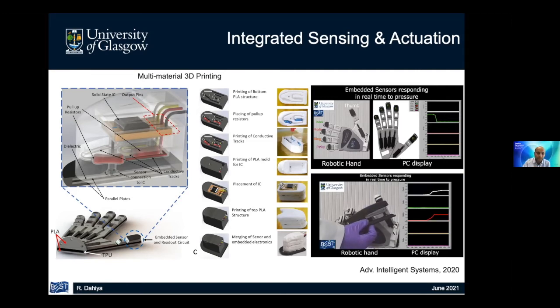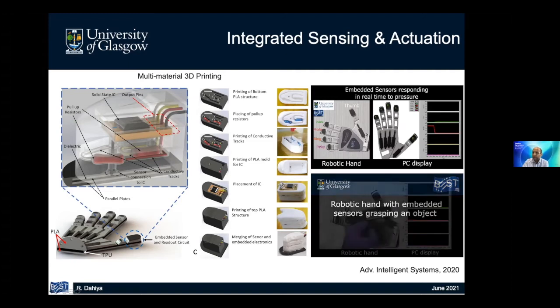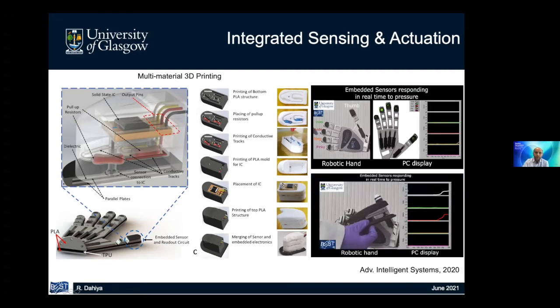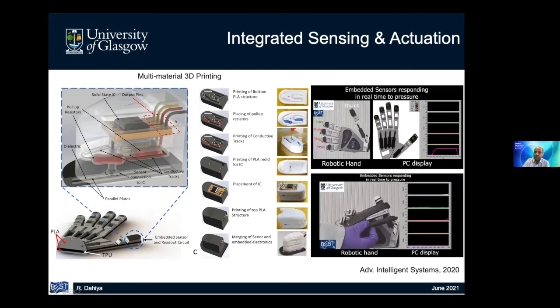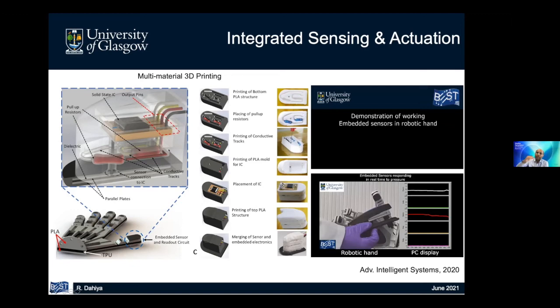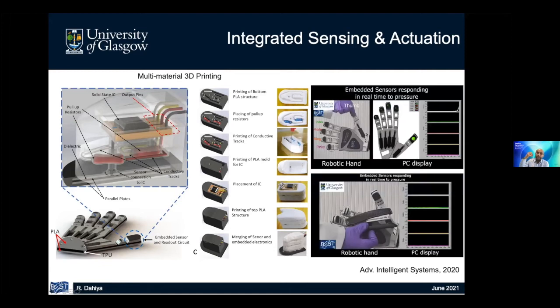And how does it happen is you start by printing the plastic, then you print the metal, and then you either fill it with PDMS or a dielectric, or leave it empty, as air can be there. And you again bring another part which has a conductive and plastic, and you can 3D print the whole structure. When you 3D print the whole structure, you can also print the interconnects as metal interconnects, and integrate off-the-shelf components at different layers, different planes. And you can develop the whole hand in this way, or it can be used to develop a surgical instrument in this way. So this is what we have used.